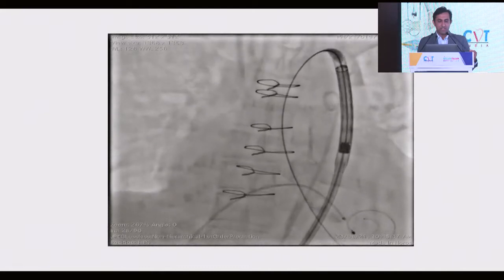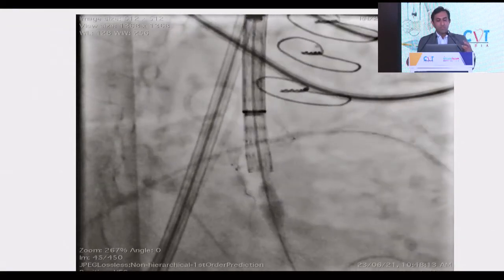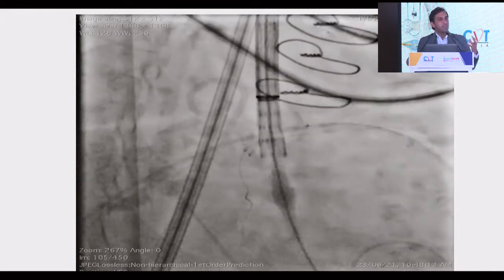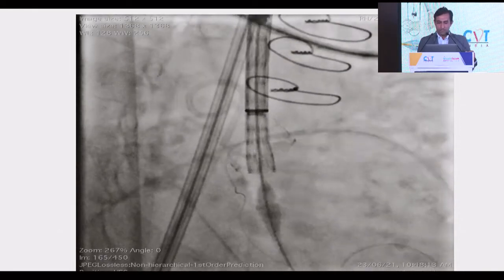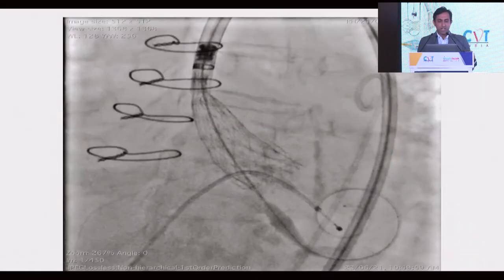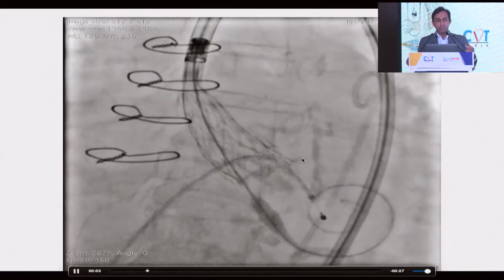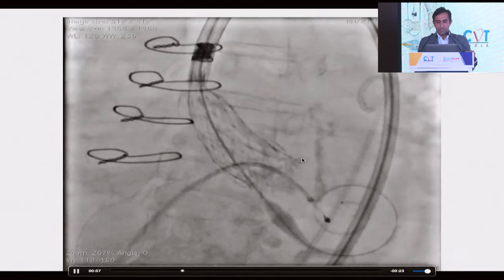And here's a 23 millimeter Evolut R. To get the benefit of supra-annular design, you need to implant it very high. If the valve is deep, the benefit of a supra-annular design is lost. So Dr. Ashok Seth, sir, has pointed out all the right steps to do a self-expandable valve. Follow these steps, zero implant, and then wait for 5 minutes and see how it goes. And then do a very slow release at the end.